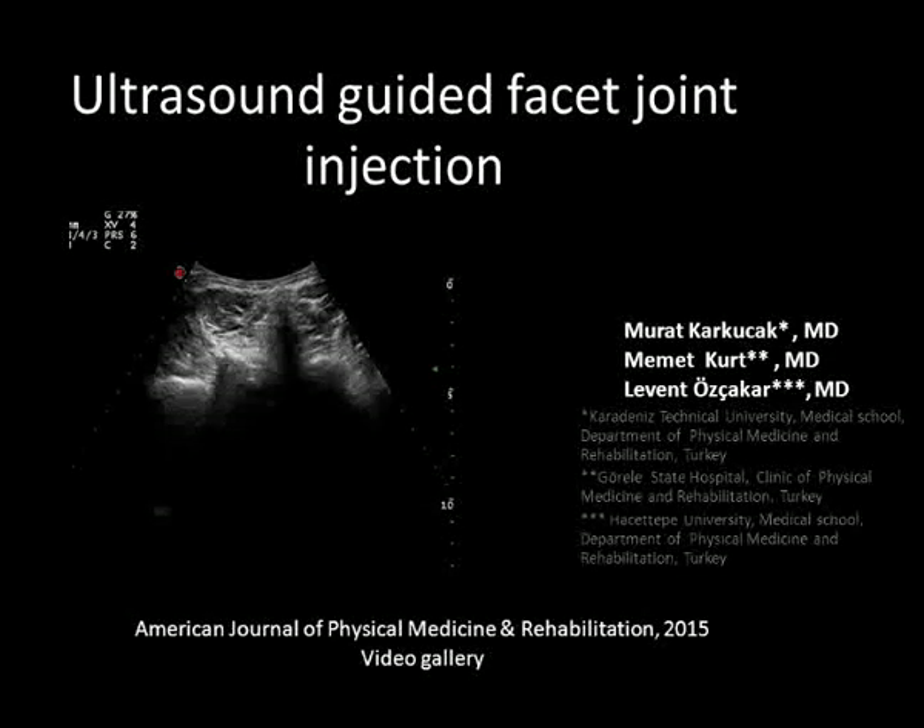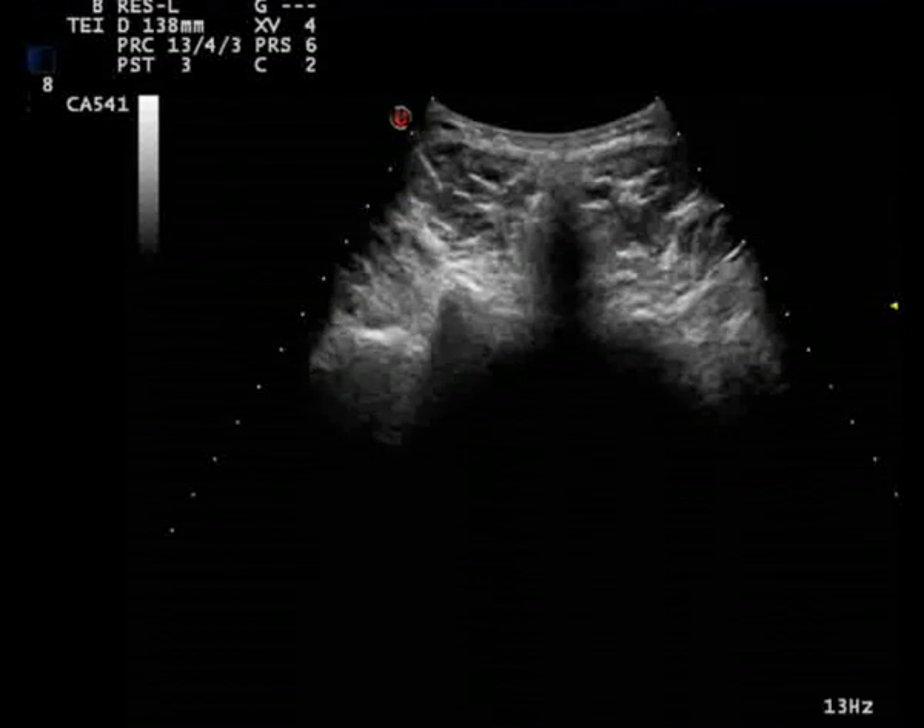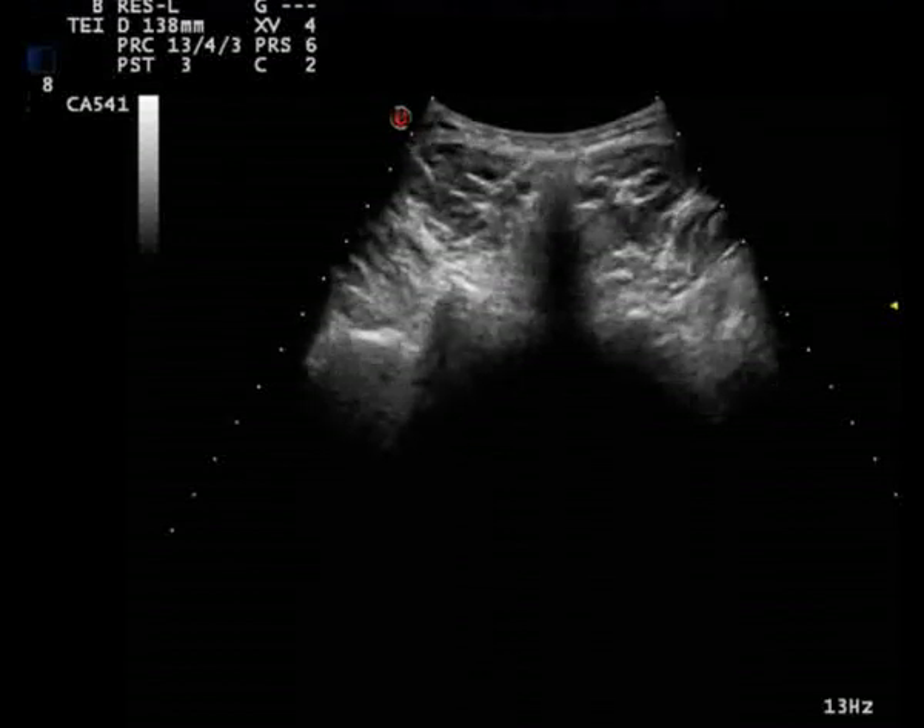In this video, facet joint injection through ultrasonography guidance was demonstrated in a patient diagnosed with facet syndrome.